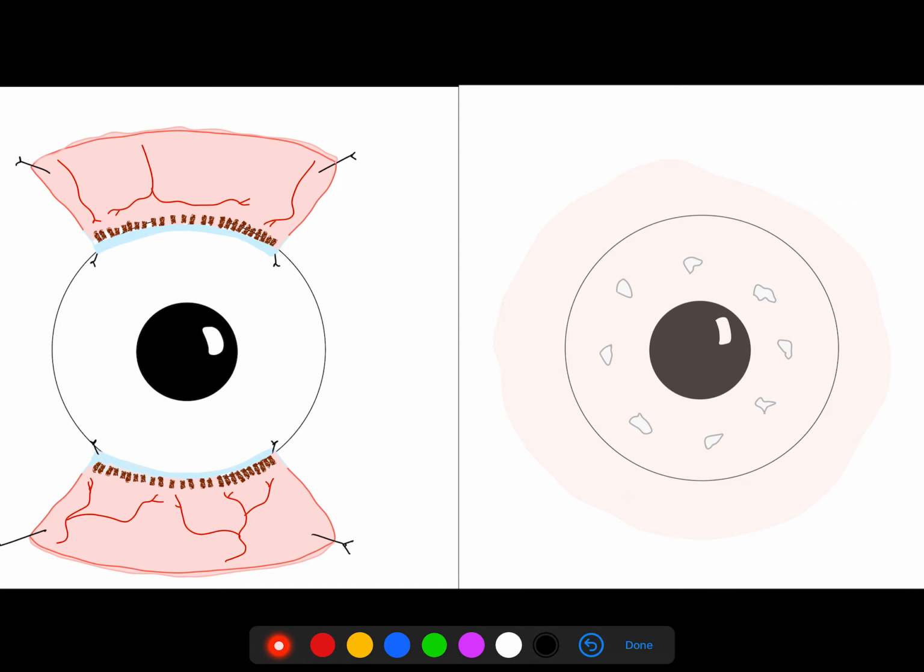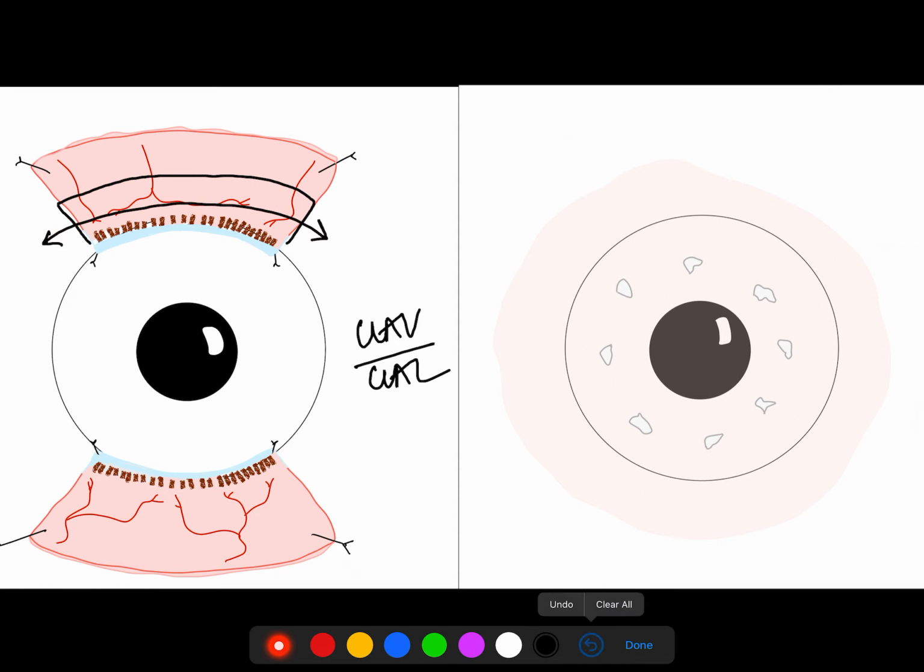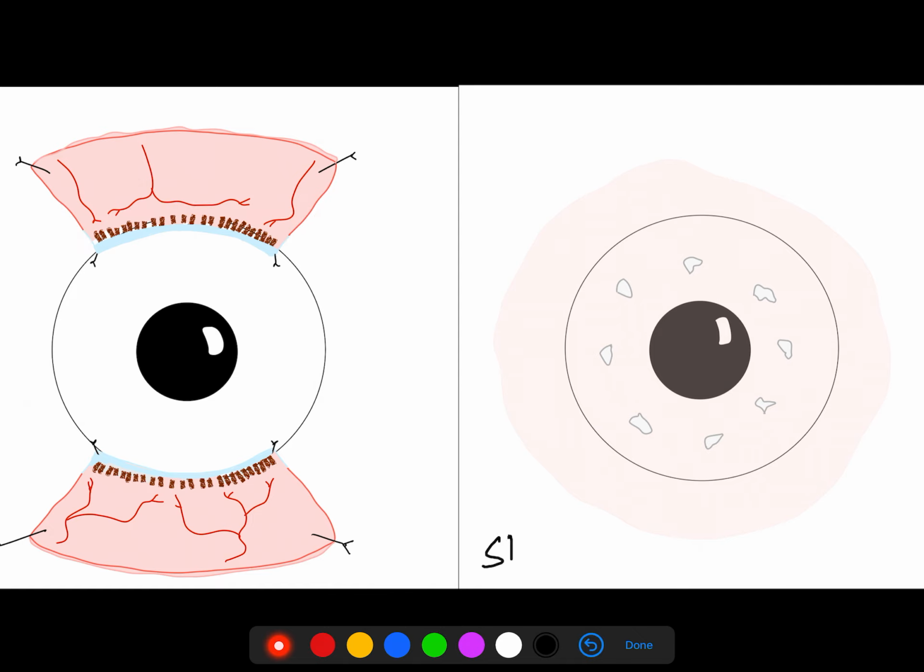Another important difference is that there is usually a very large conjunctival graft on the other side of the limbal graft in CLAU. That is the conventional technique. So in CLAU, there is always conjunctiva, like I mentioned before, or CLAL, whichever you're talking about. And therefore, there is always some conjunctiva. Now, it may not be as broad as this, it may be much smaller, but in terms of arc length, it is the same length as the limbus. Whereas, like I said, in the SLET technique, there is absolutely no conjunctiva in the tissue that is transplanted on the cornea.